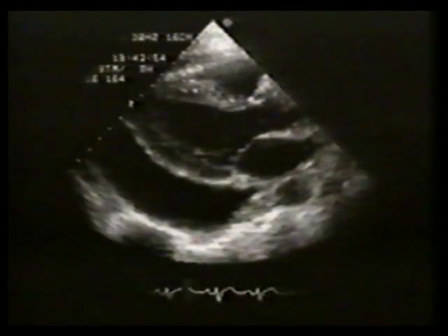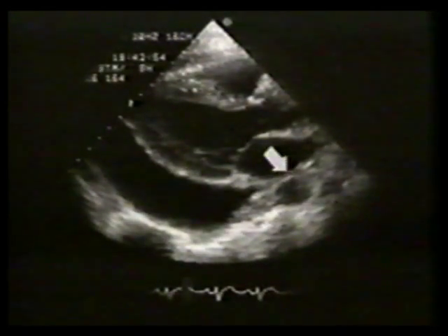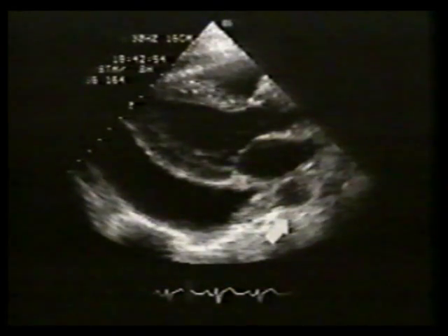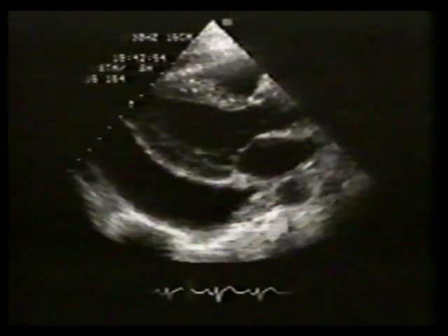Returning to the parasternal long axis view, the visceral and parietal pericardial layers join each other here, between the aorta and left atrium. The pericardium does not cover the descending thoracic aorta. Hence, with pericardial effusion, there is no fluid observed behind the descending aorta. This is important for differentiating pericardial effusion from pleural effusion.